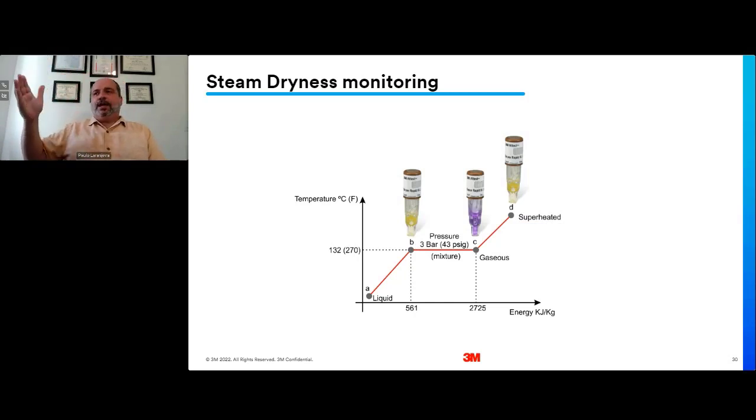BIs with a PCD are capable of detecting the other variables that are not measured by our equipment today. So we have time and temperature measured by the equipment, and non-condensable gases and steam dryness by a PCD with a biological indicator. That is why it is important to have BIs on every load monitoring. We are not monitoring the load, we are monitoring the cycle. We are making sure that the cycle my devices are being exposed to has the correct quality to promote sterilization.